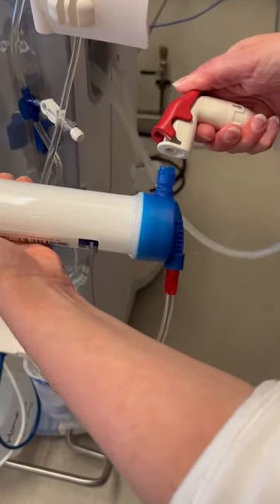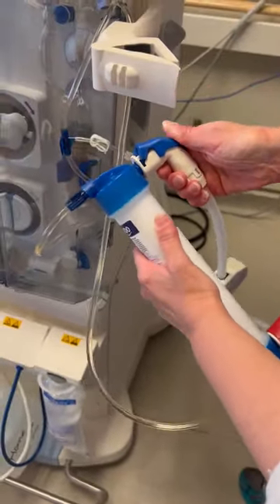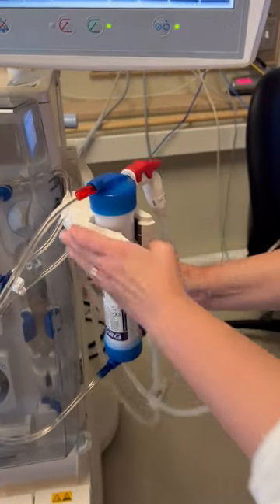When we do this, you go red to red, blue to blue, and then we're going to want to put it back in the holder right side up.